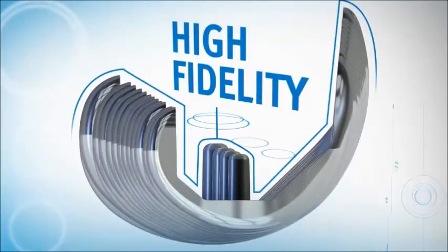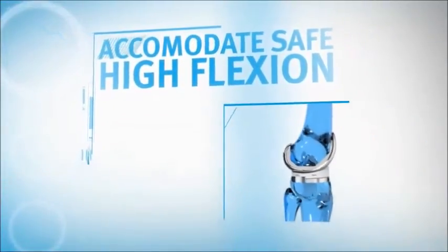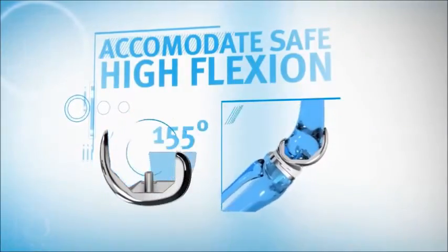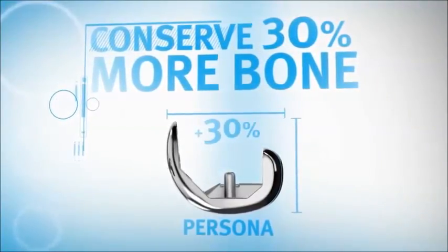Zimmer pioneered HyFlex design, and Persona takes it to the next level — preserving the contact area that surgeons expect, accommodating safe and stable flexion up to 155 degrees, while setting a new standard in bone conservation, conserving 30% more bone.